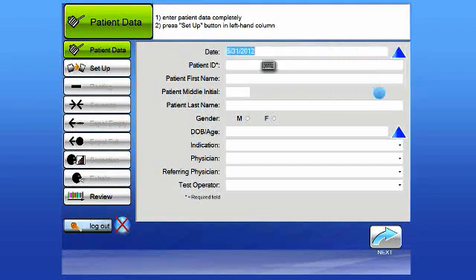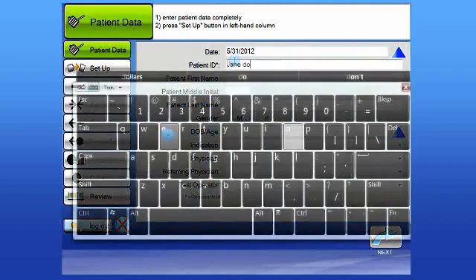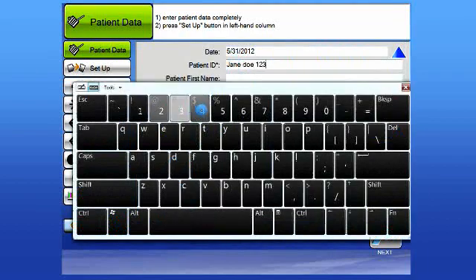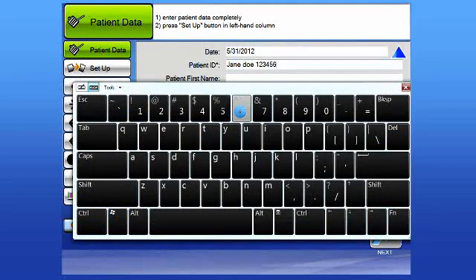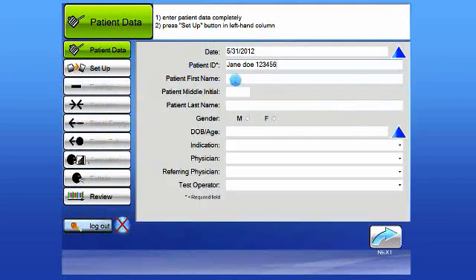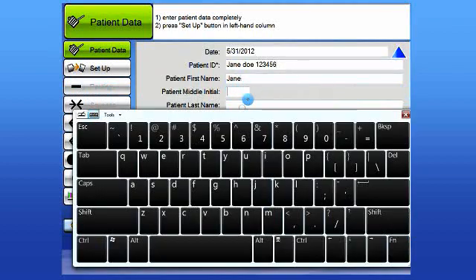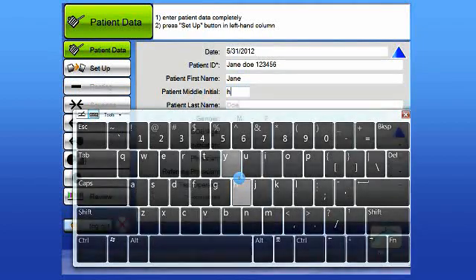The patient ID field is then entered. You may use any combination of letters or numbers in keeping with your particular clinic's standards. The next entry field, also optional, is the patient's first name, the middle initial, and then the patient's last name.